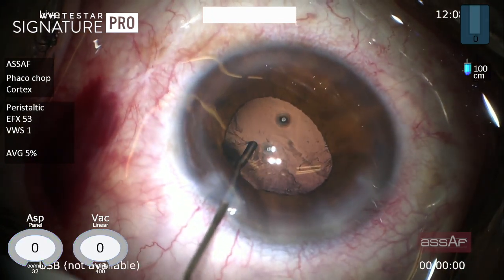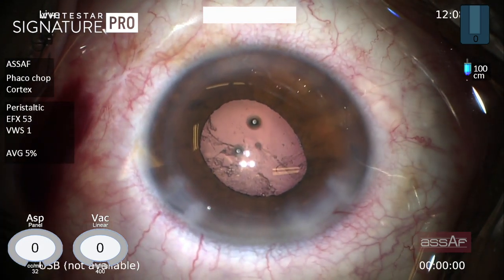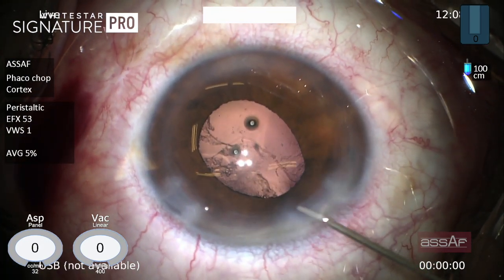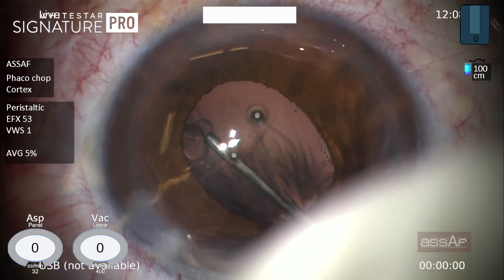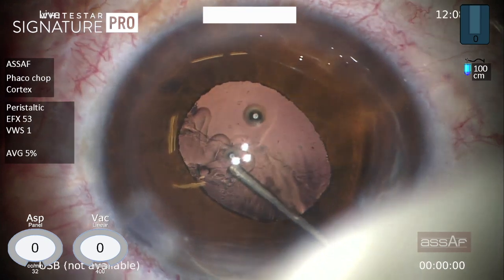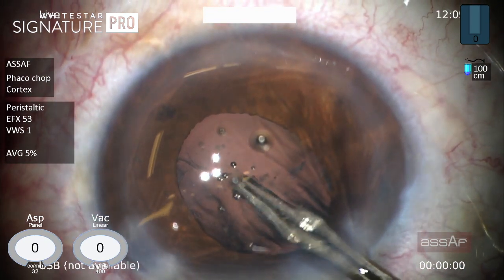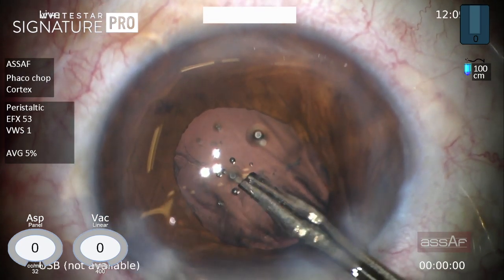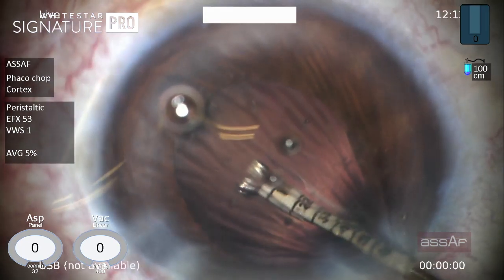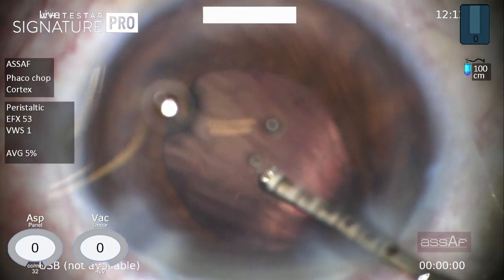Finally, we are left with some cortical fibers adherent to the posterior capsule at the visual axis. I'm trying to do some viscodissection to clear these fibers away from the posterior capsule. However, having failed, I tried to mechanically peel those fibers off the posterior capsule with the rhexis forceps — micro-rhexis forceps — trying to remove those fibers at the visual axis.